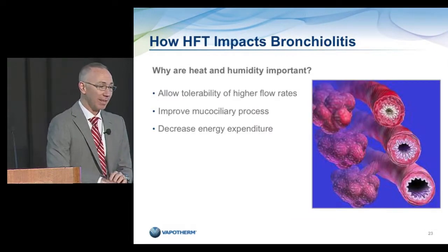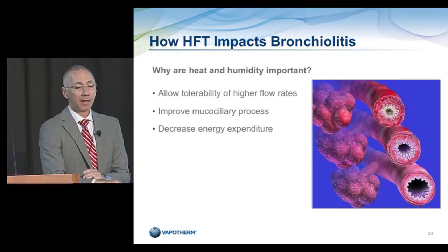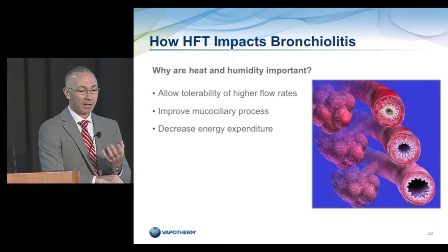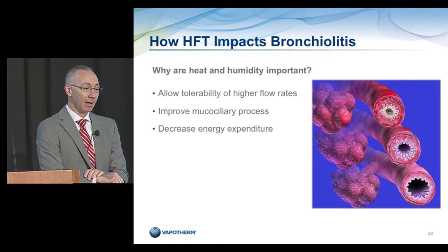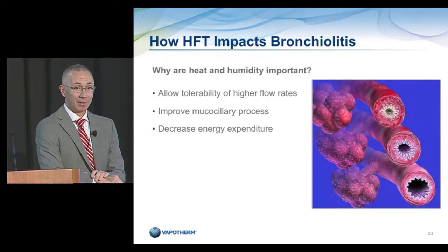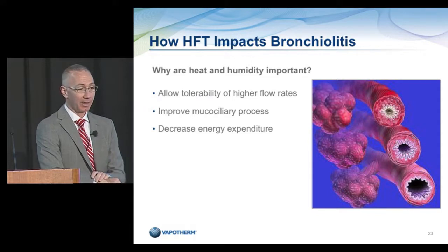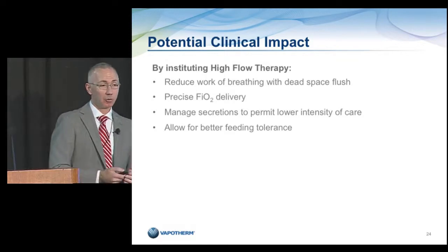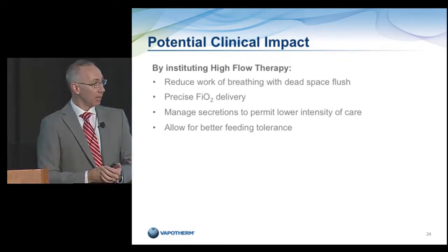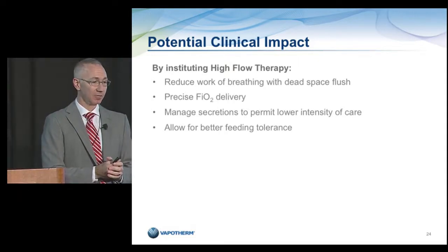Proper humidification and heating improves mucociliary clearance, and it also decreases energy expenditure. For one, you are offsetting the highest resistance of the airway, which happens in the extrathoracic airway. And second, you have lower energy expenditure because you don't have to spend energy to heat up the gas or hydrate the gas as we normally do when we breathe standard tidal volumes. So the potential clinical impact is that we will reduce work of breathing because of the dead space flush. We will be able to provide a precise oxygen concentration delivery to this patient.